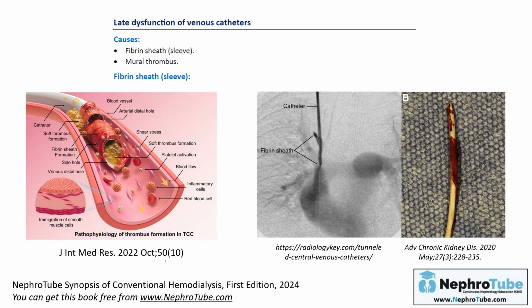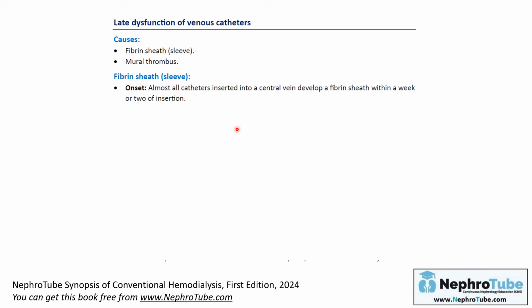I will mention the imaging later. We mentioned that almost all inserted catheters have a fibrin sheath within a week or two.